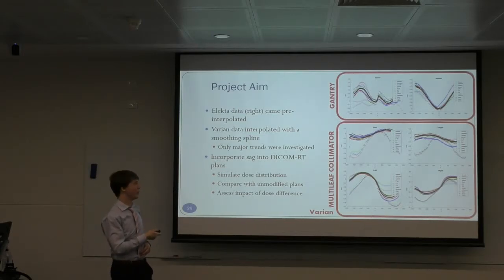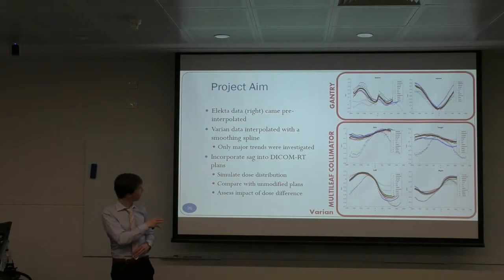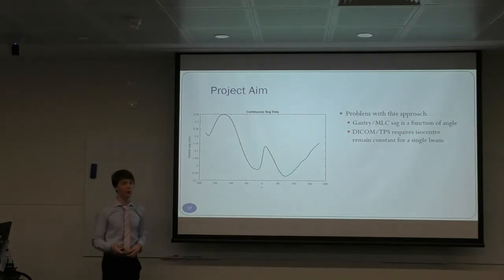And what I aim to do in my project is to look at this SAG and incorporate it digitally into these DICOM files so that I can simulate dose distributions and see just how this affects the distribution of dose, so that I can compare them and from there use different metrics to understand how it would impact a clinical treatment.